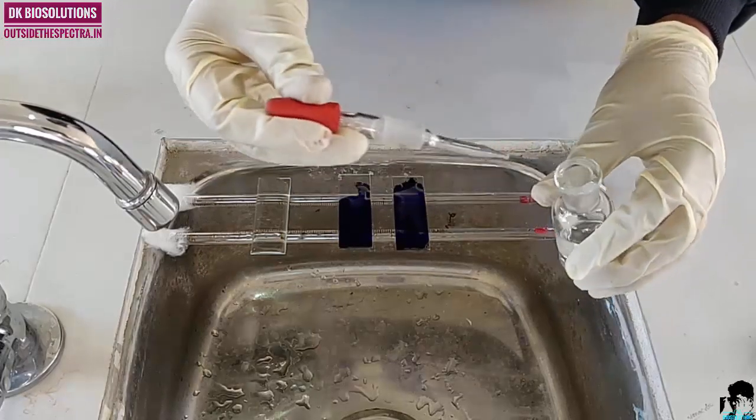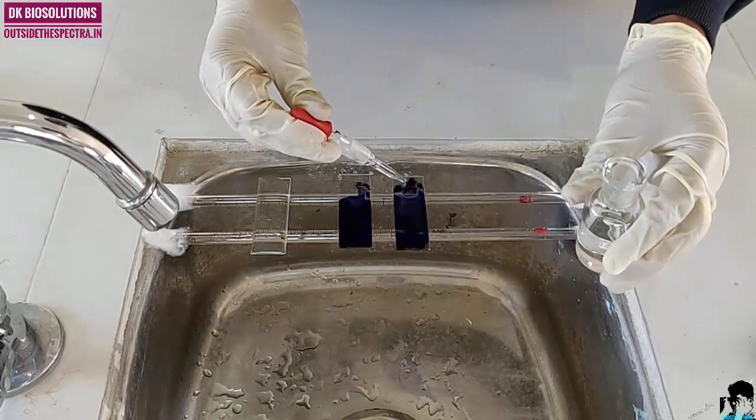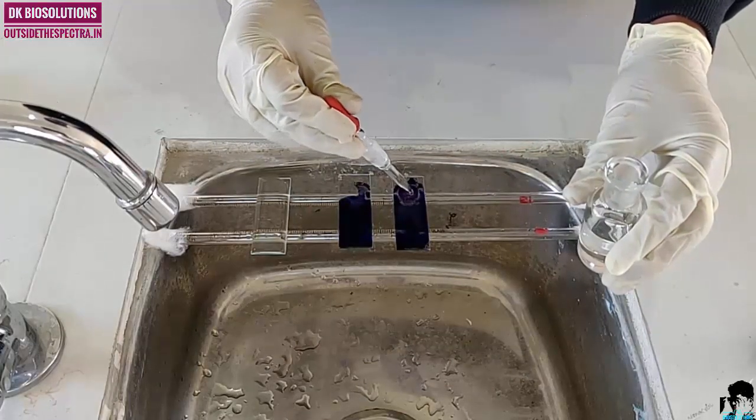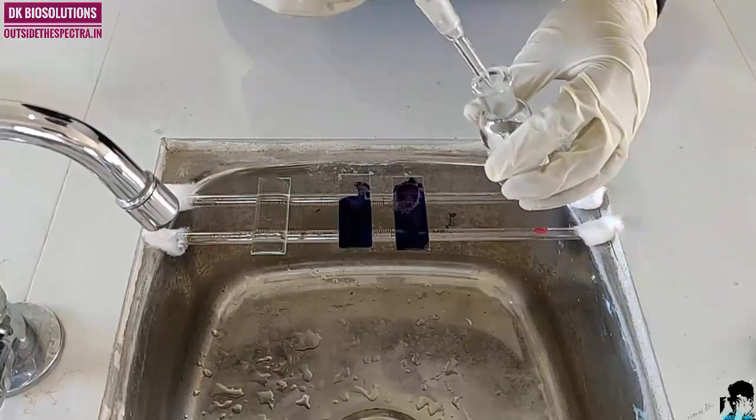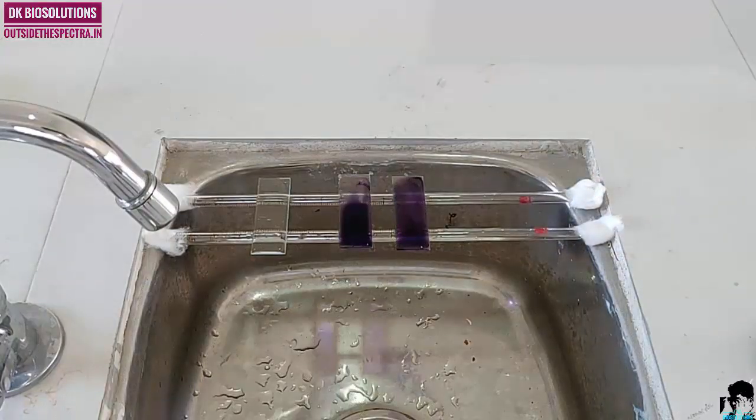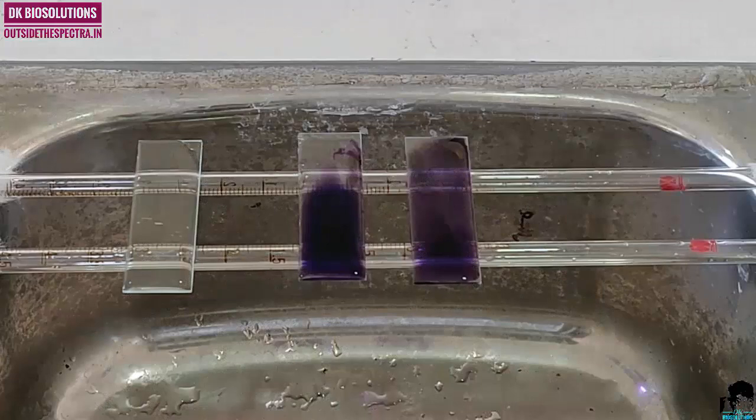After two minutes, add double amount of distilled water or Leishman buffer over the film carefully. You will observe golden scum on slide after adding Leishman buffer. Now, we have to wait for eight to ten minutes.